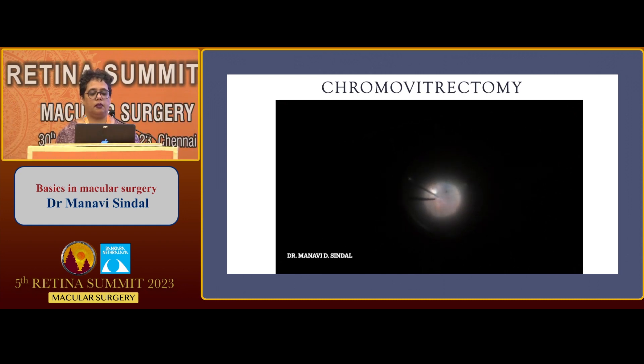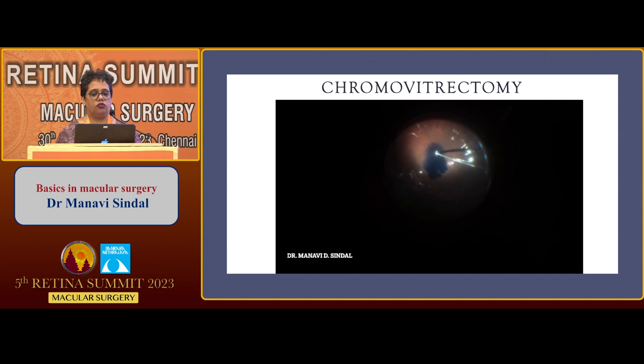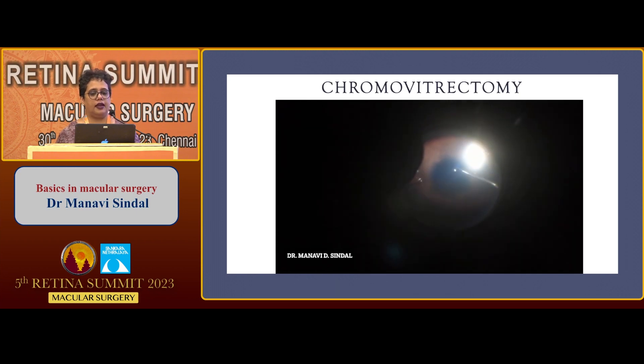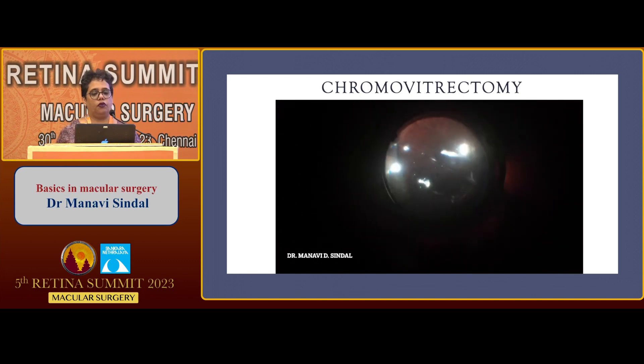The staining can also be done by making the Brilliant Blue heavy: take 1.5 cc of the dye and mix it with 0.5 cc of 10% dextrose. This heavier dye settles over the posterior pole, allowing more contact with the ILM and thereby making the staining more intense and darker. The dye can be left in situ for about a minute or two. Alternatively, Brilliant Blue can be applied under air. Both methods — making it heavy or staining under air — cause darker staining of the ILM and slightly dehydrate it, making peeling a little easier. Novice surgeons are better off using these methods before moving to staining under fluid for a few seconds alone.